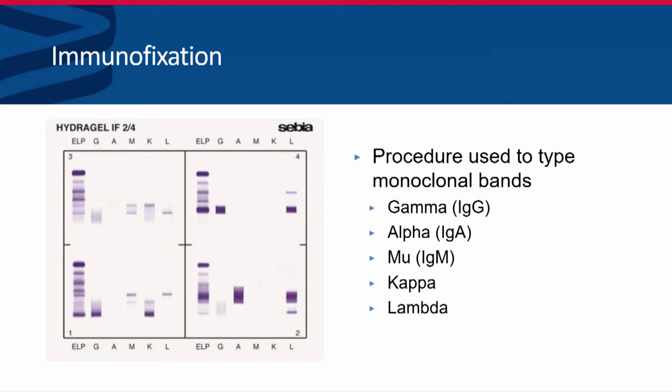We will then say, so you don't need to ask it, some people say serum electrophoresis and immunofixation. We reflex immunofixation. So what is immunofixation? Immunofixation is where we actually treat it with anti-serum, and that anti-serum just gives us tags on the protein. And then you've got, as you can see, G, A, M and kappa and lambda, K, L. And this just separates it out.